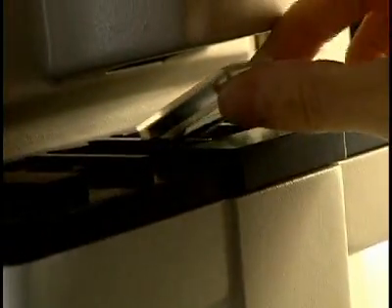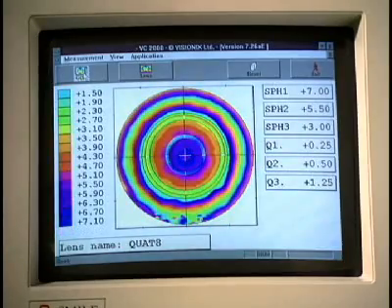This optical topographer is used to verify, through color distribution, whether the spread of optical power in the lens is precise enough to assure perfect vision.